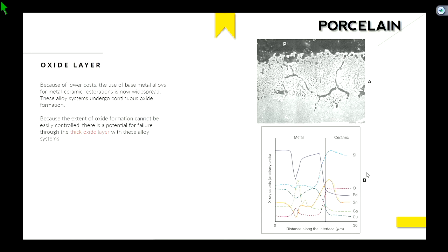Question? What is the hybrid layer? Okay, so this is P for porcelain. This is the metal, and you see how it's sort of sprinkled. How do you describe it? It looks different. Porous? Okay. Integrated? Sure. Like a hybrid between the two? Basically, the idea is that parts of each component have intermixed with each other, forming an area that's bonded together.